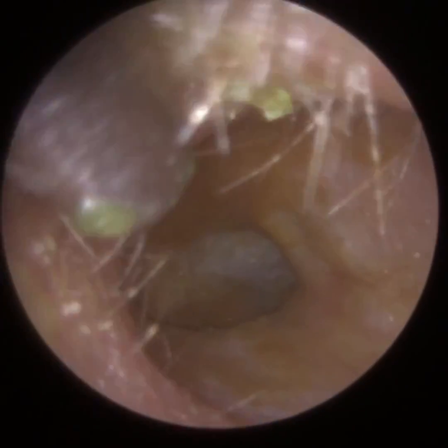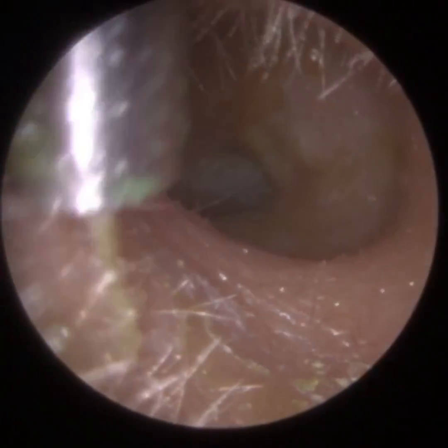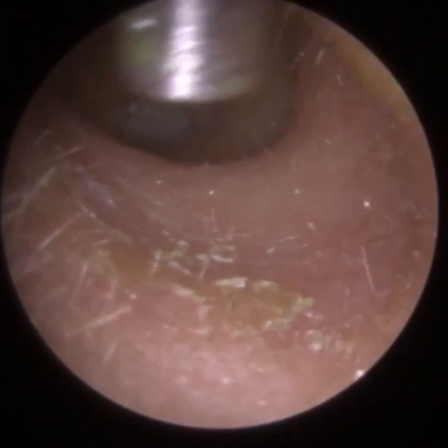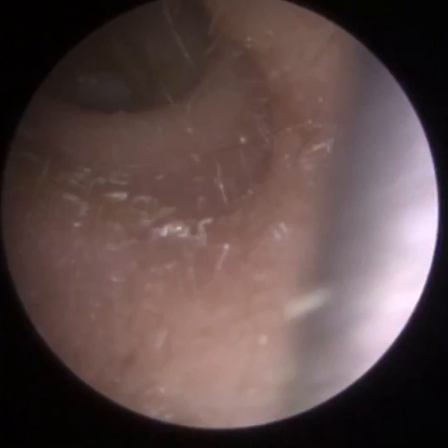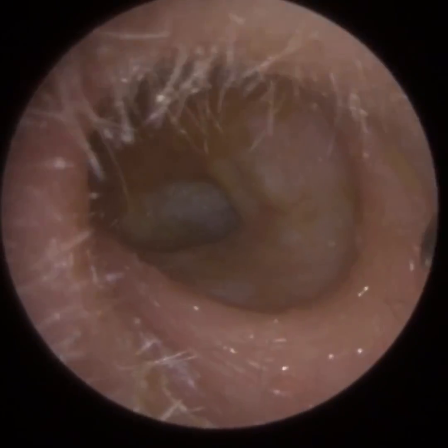So again, just near the entrance here, just some dry skin. I did put some drops in there, I had to because it's too crusty, it was blocking the tube as well, so just to loosen it. And obviously we suctioned all this, the dampness out as well. And already it just looks so much better, so much clearer.